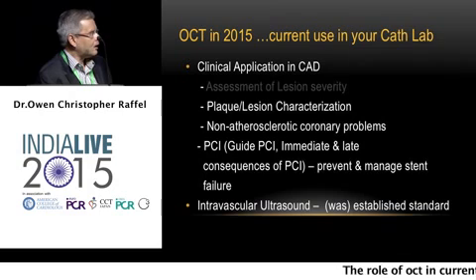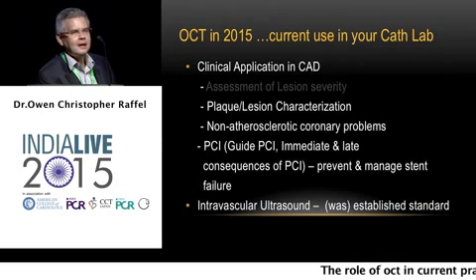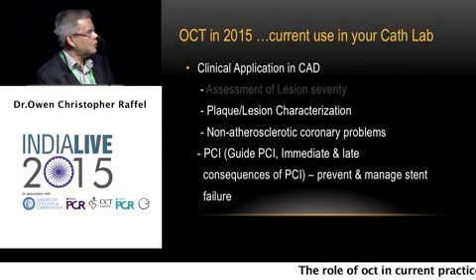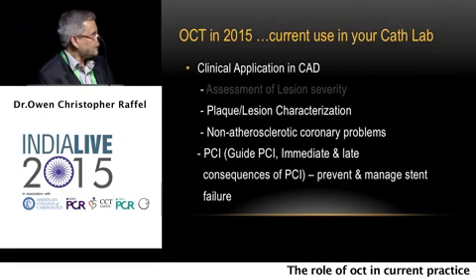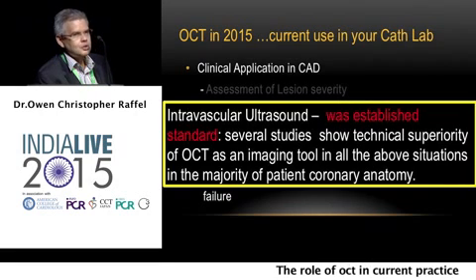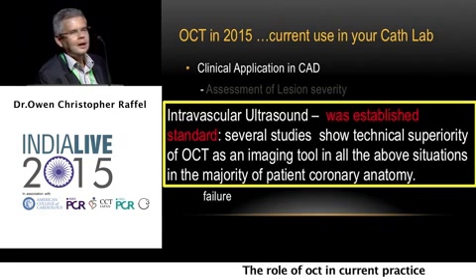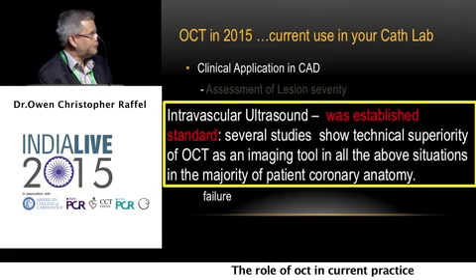Up to a few years ago, I would say, ultrasound was the established standard, and I say was, because in my opinion, OCT has taken over that role. And now there are several studies which show the technical superiority of OCT as an imaging tool in managing all of these scenarios in the cath lab.